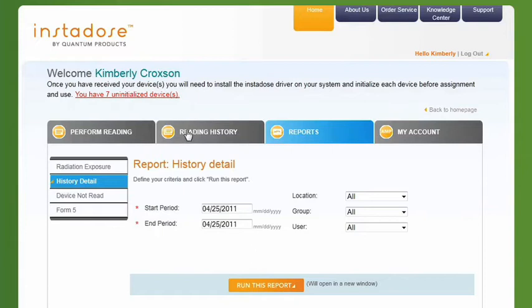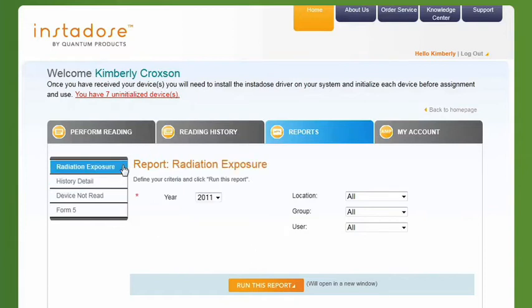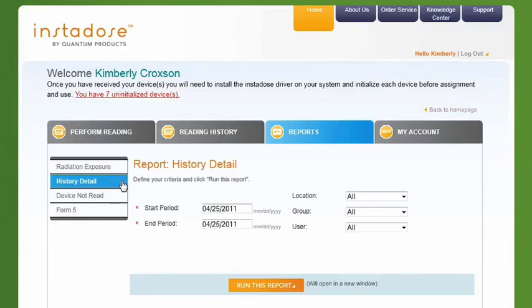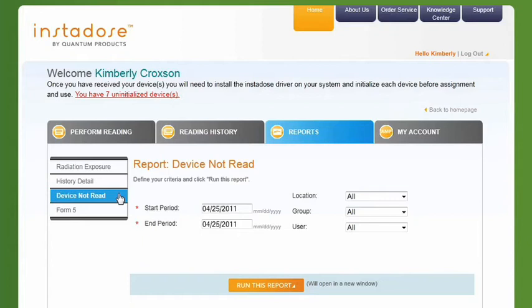The following reports are available. The Radiation Exposure Report is the most common report, as it provides quarter-to-date, year-to-date, and lifetime exposure levels. The History Detail Report contains every single read that has been performed. The Device Not Read Report can tell you who has not read their device among multiple devices in your account, based on parameters you set.